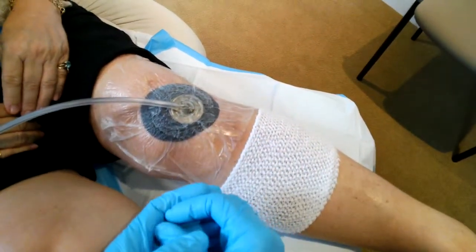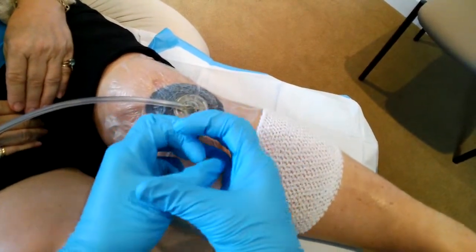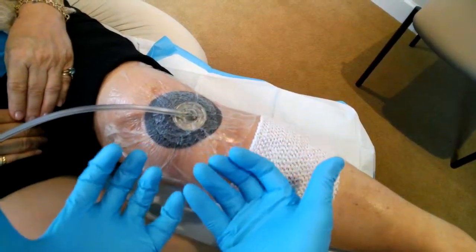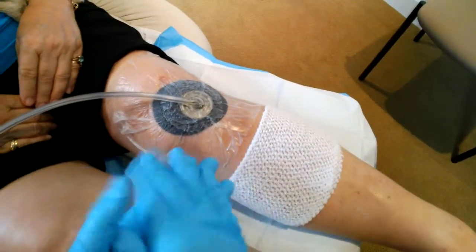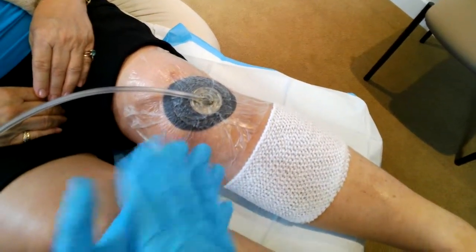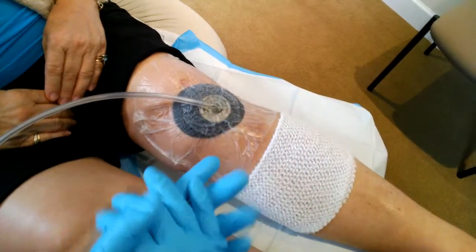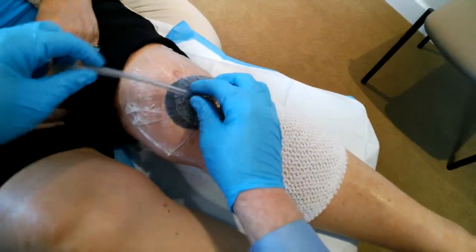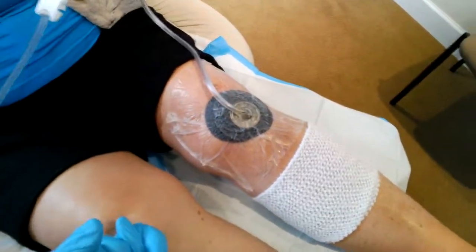What the sponge will do is create a healthy environment by suctioning the wound. It will cause it to contract down, and the little holes in the sponge are going to stimulate granulation tissue and healing. This is changed usually Monday, Wednesday, and Friday. This device has really been just a miracle to help wounds heal in a much more quick way, and has saved a lot of time in terms of length of wound healing. Our patient is going to go home now — we'll see her probably next week and hopefully get a skin graft on that wound and get her to healing.